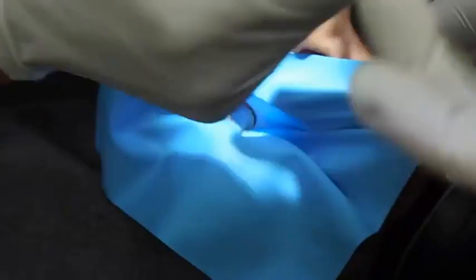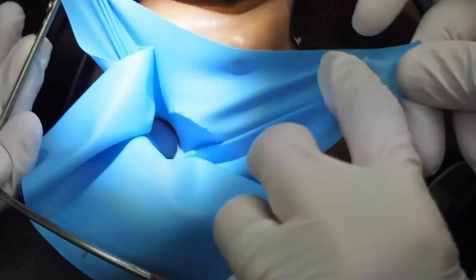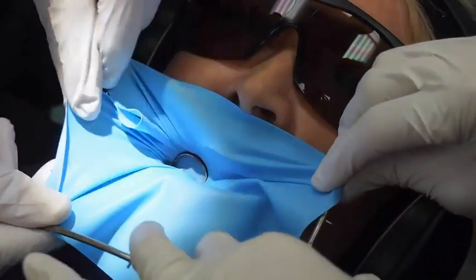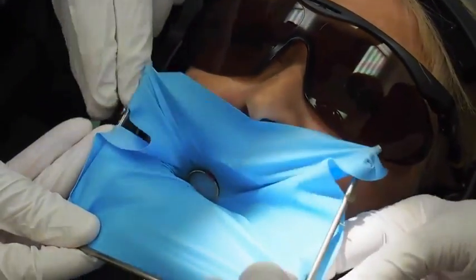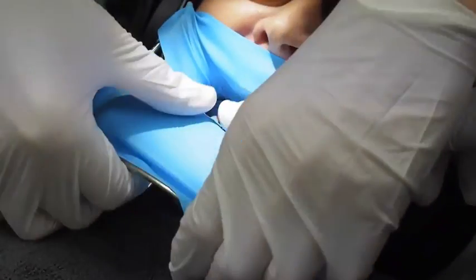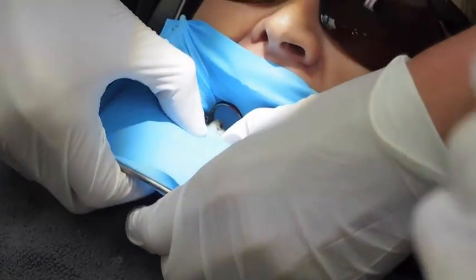I always get the clamp in place first and then place the frame. The frame will then hold everything secure while you do the rest of the rubber dam application, including the flossing and the aversion of the sulcus and releasing the clamp. Generally I hold the anterior part of the rubber dam down into the first contact and have the assistant floss this one.